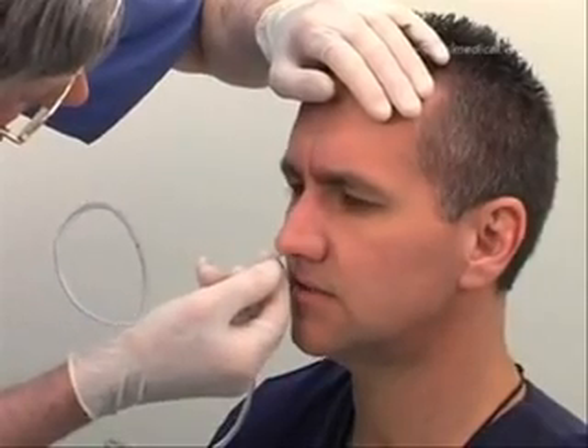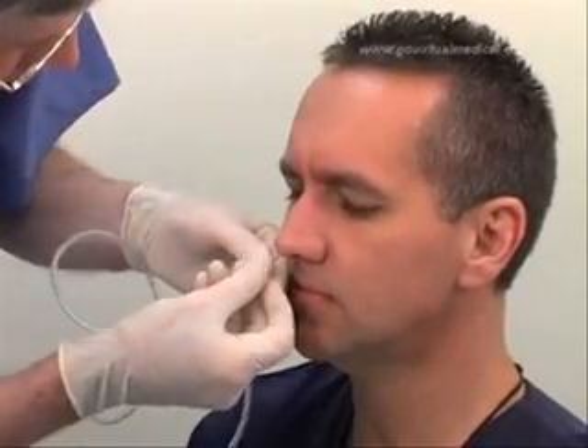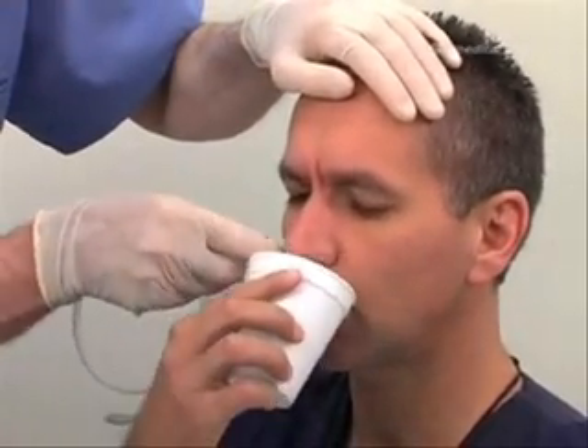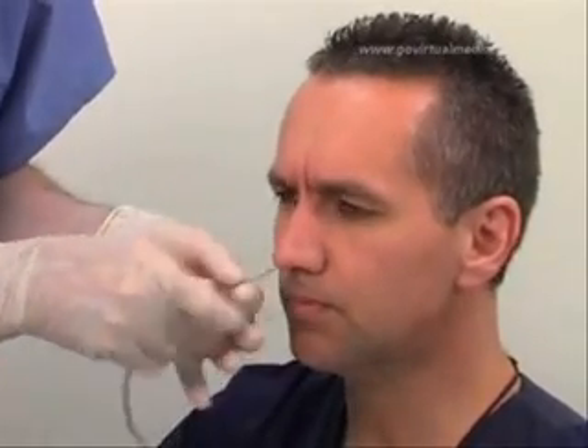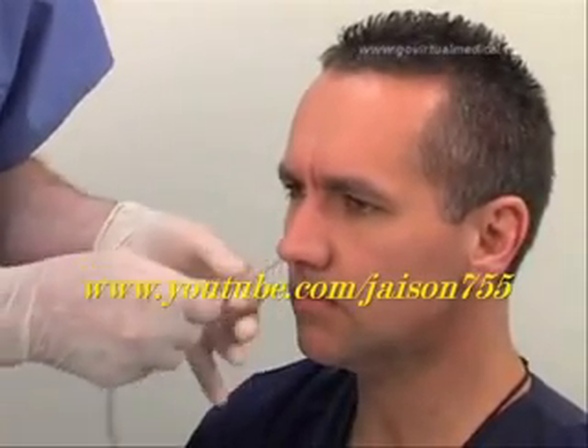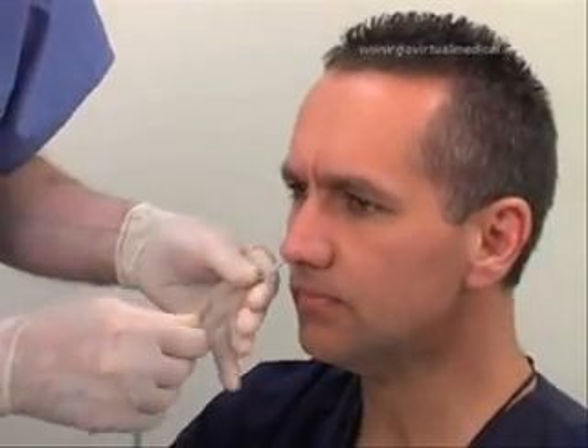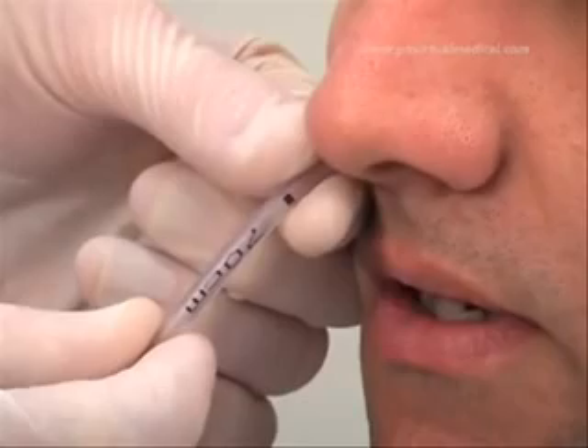Twist the tube 180 degrees. If not contraindicated, ask the patient to sip some water and to swallow slowly. Continue to insert the tube until the predetermined length has been reached.